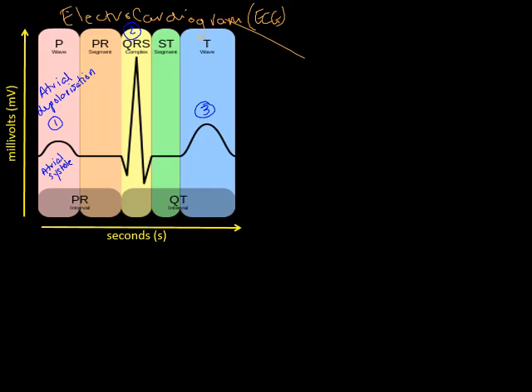So this is a very, very tall spike in millivolts in voltage, because we know the ventricles are significantly bigger than the atria, and the muscle wall is a lot thicker. So in order for the ventricle to contract, there has to be a big voltage passed across the ventricle walls to allow that really high build-up of pressure, ventricular pressure.